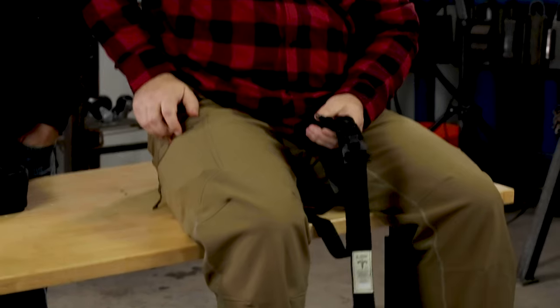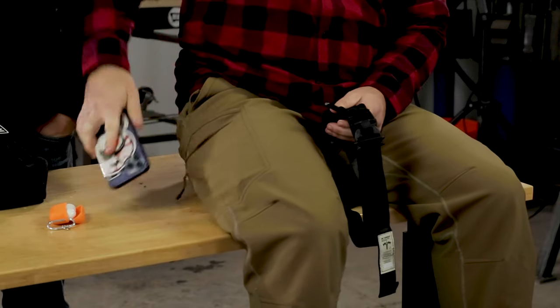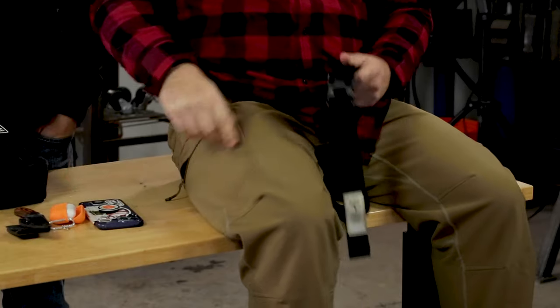When we're using this on our leg, we assume that we have both hands available. The first thing we want to do is make sure that we don't have any obstructions, so take stuff out of the pocket and keep it close by because you need to call for help. This buckle is going to slide apart — if we push at an angle, you can get it apart just like that. It's less important which way we pull the strap because we have both hands available.